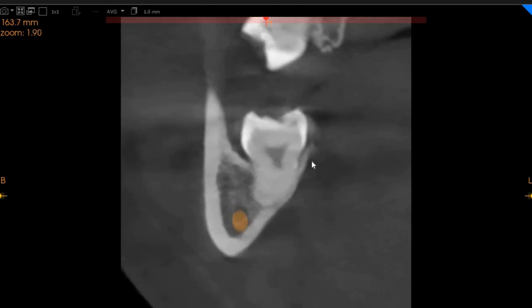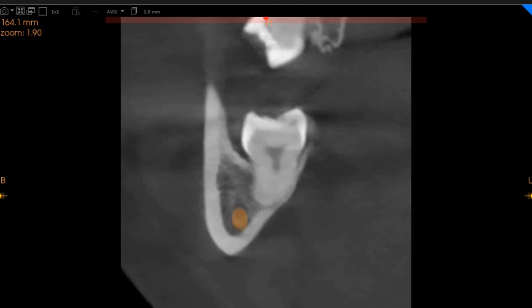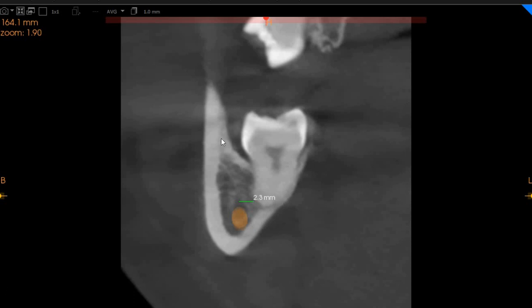Here you can see that the wisdom tooth is straight. It is not completely impacted into the ramus. You've got an area of buccal guttering here. The inferior alveolar nerve is buccal, approximately two millimeters away from the apex of the wisdom tooth root.